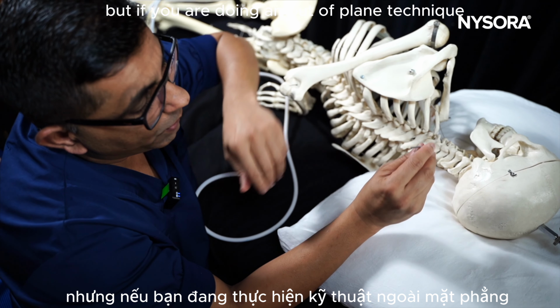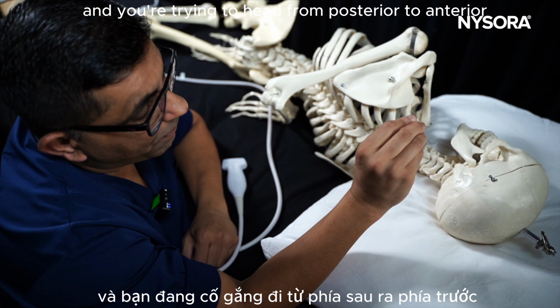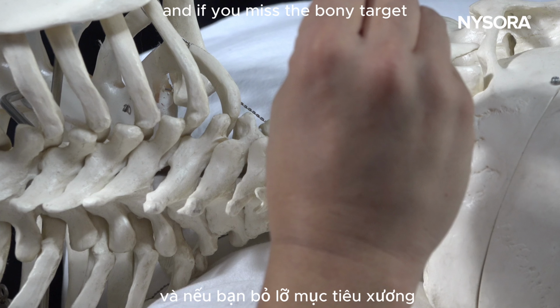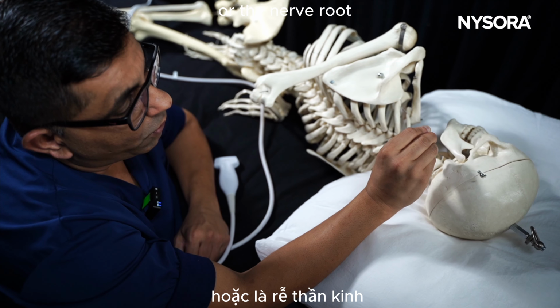But if you are doing an out-of-plane technique and you head from posterior to anterior, and if you miss the bony target, you will end up getting into either the vertebral artery or the nerve root.